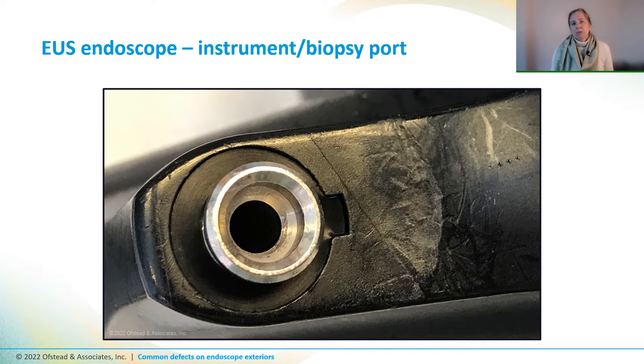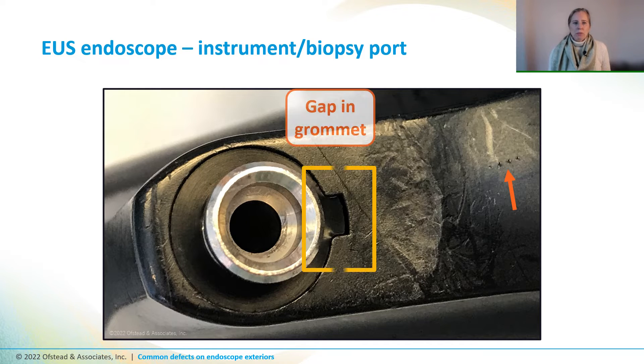The area around the biopsy port on this EUS scope has some pretty deep scratches and gouges that look like someone poked it with something sharp like a needle. There's also a little gap around the grommet that could possibly allow fluid and patient secretions to get up inside the scope.